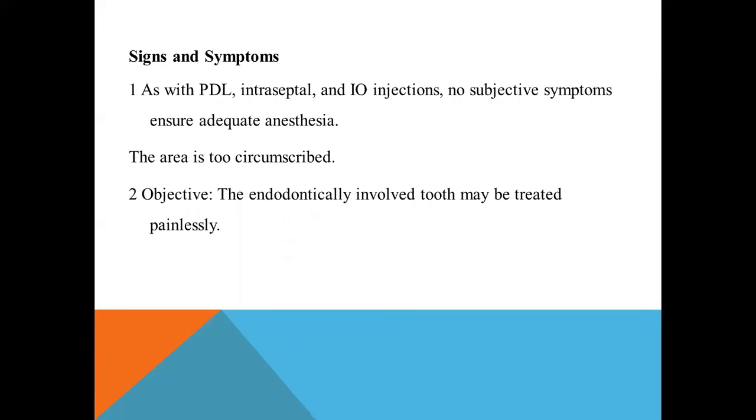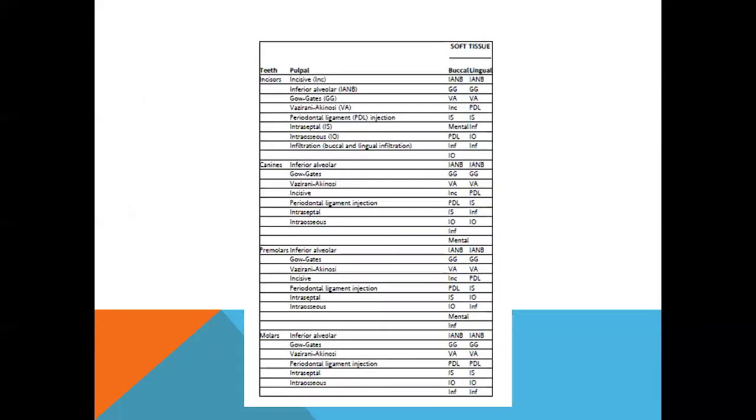Signs and symptoms: as with PDL, intraseptal and IO, no subjective signs and symptoms ensure adequate anesthesia. Objectively, endodontically involved teeth may be treated painlessly.